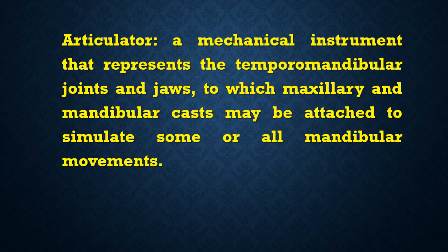I say to simulate because whatever the advancement in articulator manufacturing, we still cannot duplicate all mandibular movement, because we are dealing with a human being, soft tissue and muscles, and the articulator is actually made of metal, so you could not duplicate. It's rather to say to simulate some or all mandibular movement.